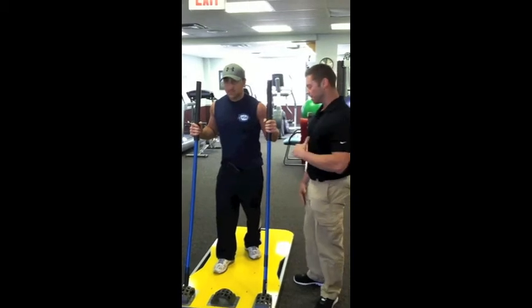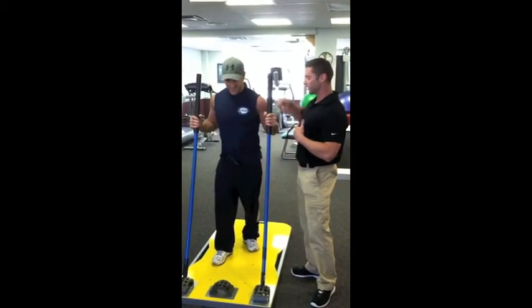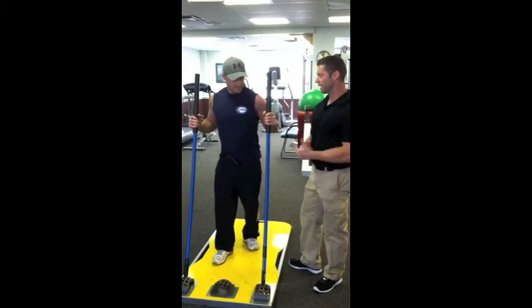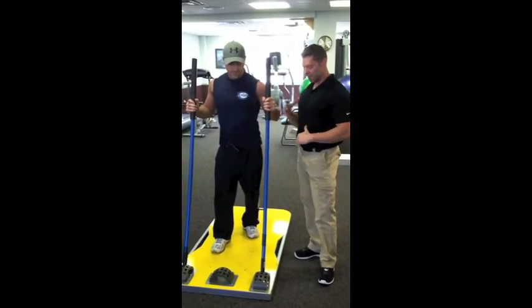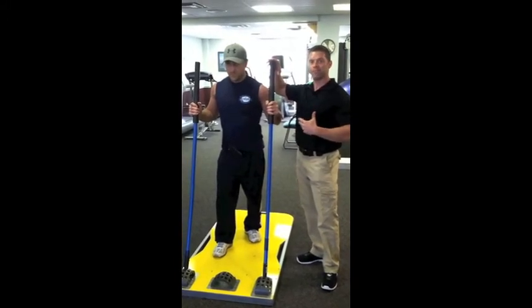I'm Peter from Bethpage Physical Therapy, this is Joe. We're recovering from a pec major repair, about 14 weeks out. Joe has made really good progress, and what we're demonstrating is a new piece of equipment we've been utilizing in our care — it's Core Stix. Basically these are rods of resistance that vary from very easy to maximum effort resistance.